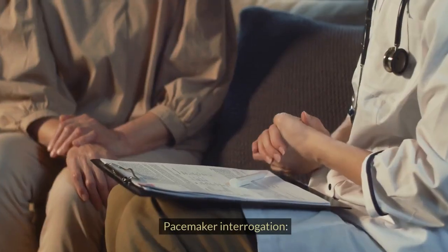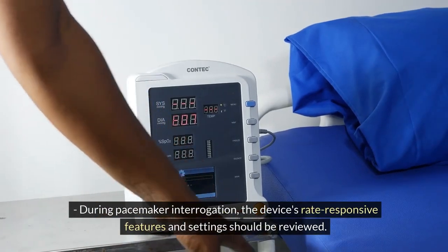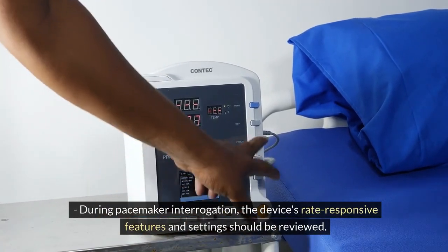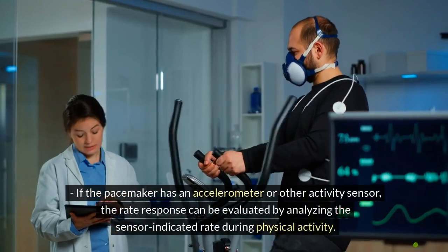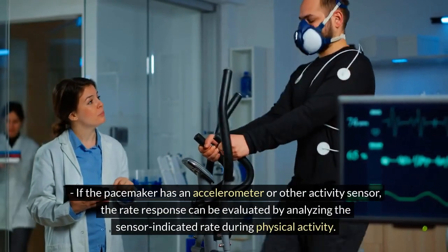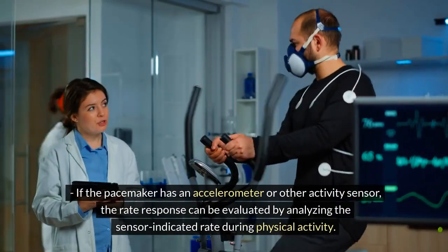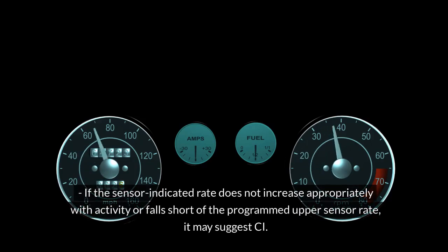1. Pacemaker interrogation. During pacemaker interrogation, the device's rate-responsive features and settings should be reviewed. If the pacemaker has an accelerometer or other activity sensor, the rate response can be evaluated by analyzing the sensor-indicated rate during physical activity. If the sensor-indicated rate does not increase appropriately with activity or falls short of the programmed upper sensor rate, it may suggest CI.